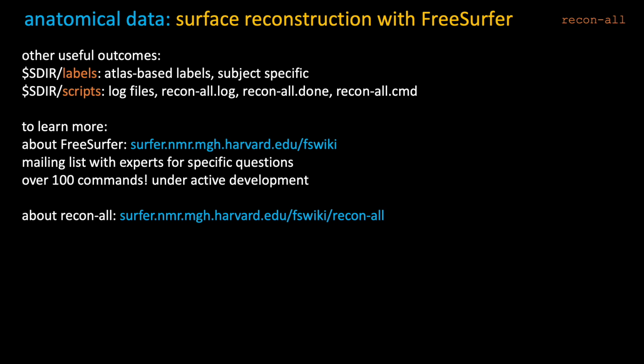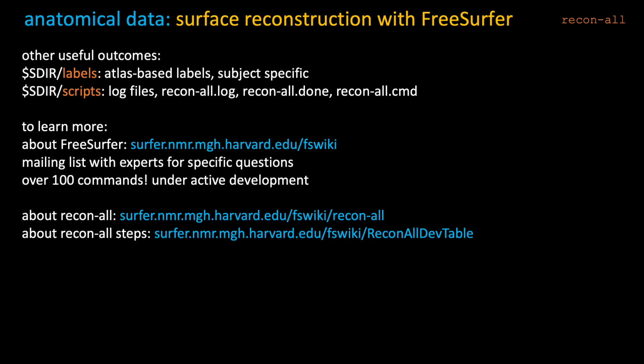There's, of course, a sub-page of this wiki for recon-all. And there's one page that I personally really like and I find it very helpful.